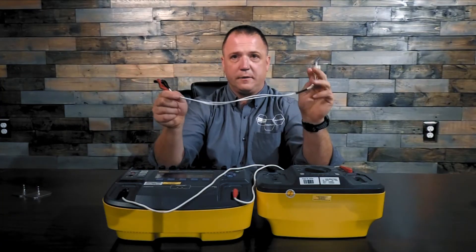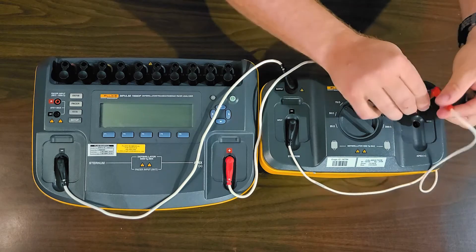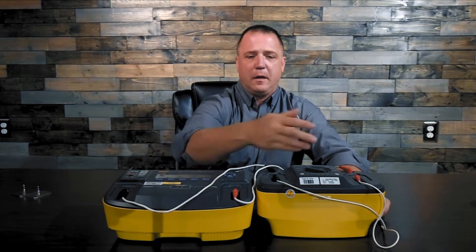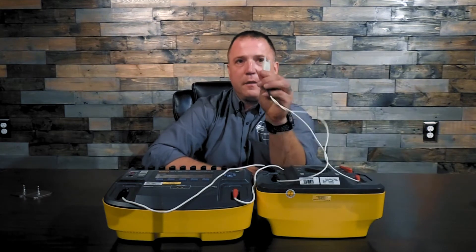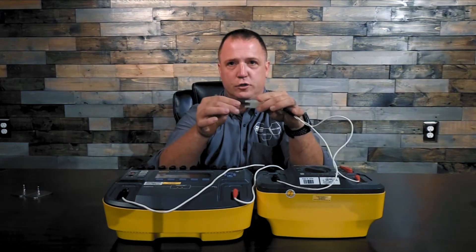Now simply take the hands-free adapter cable, black to black, red to red. Normally I'd have this sitting in front of the Impulse 7000, but to get everything in the camera I'm going to leave it back here because I don't ever like crossing cables. The other side of the hands-free adapter I'd simply take to the multifunction cable of my defibrillator and connect it.